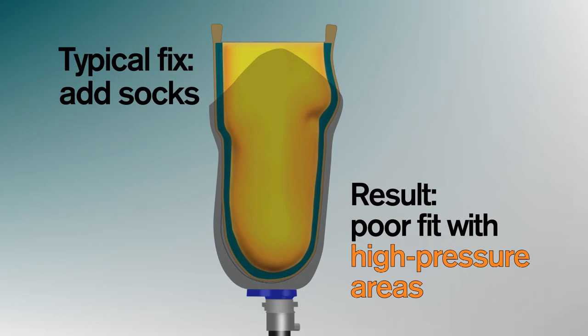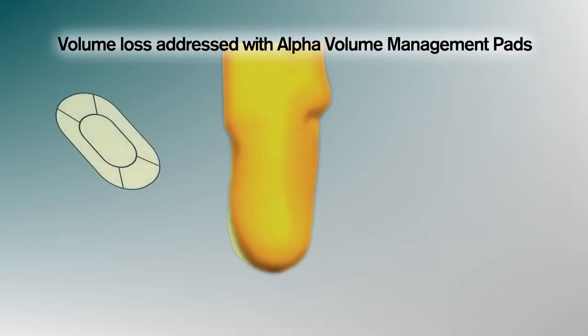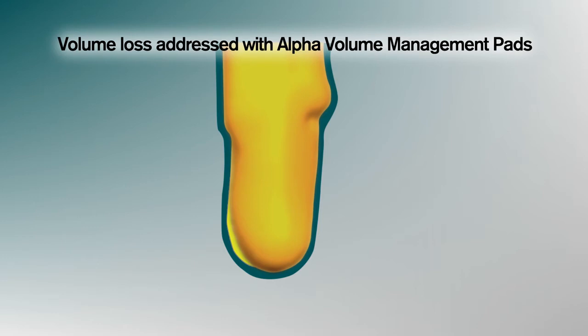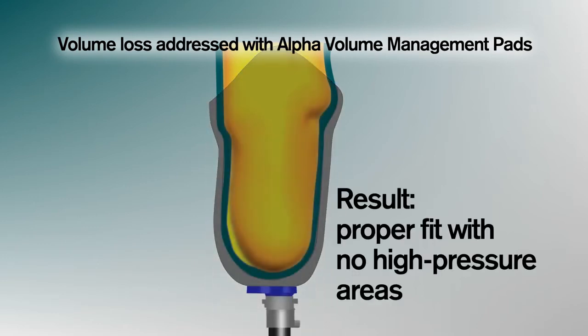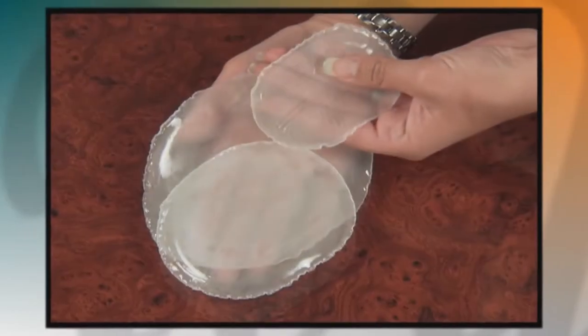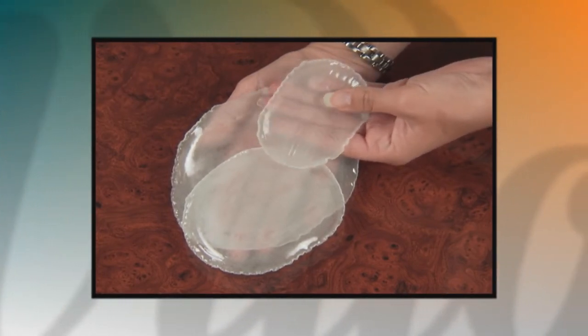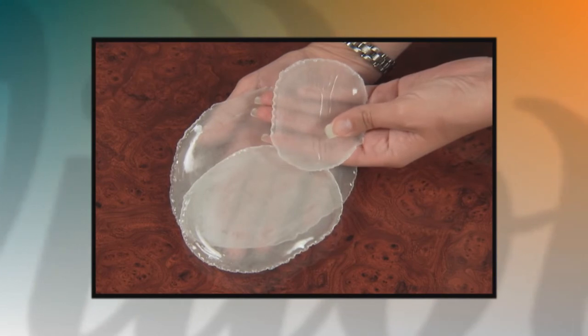Instead, your prosthetist may recommend using alpha volume management pads to add volume precisely in the area where it was lost. Simply place the thin, tapered edge of the pad against the skin, then don the alpha liner. Multiple pads can be stacked on top of each other if necessary. The result is a proper fit with no areas of high pressure. If you have any questions about alpha volume management pads, please contact your prosthetist for more information.